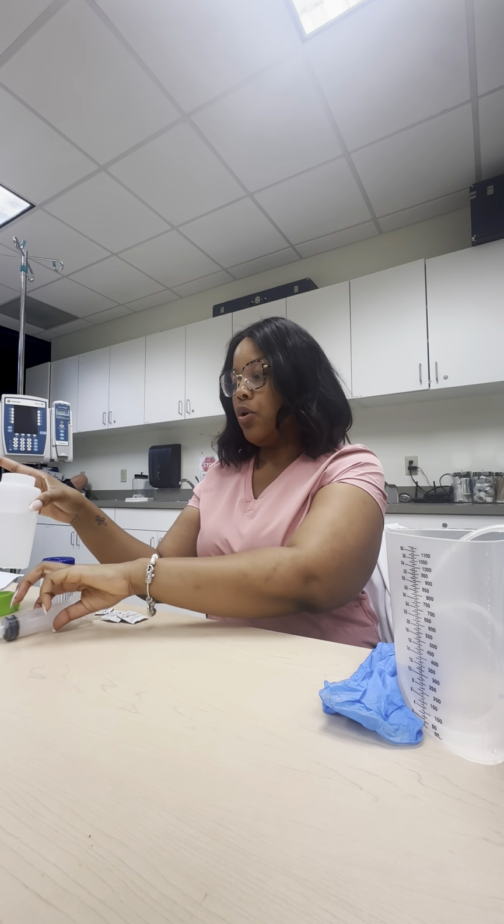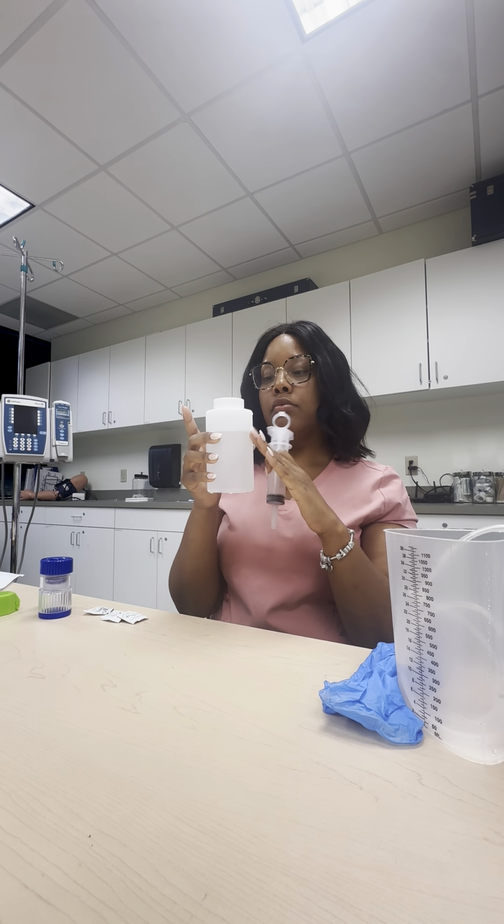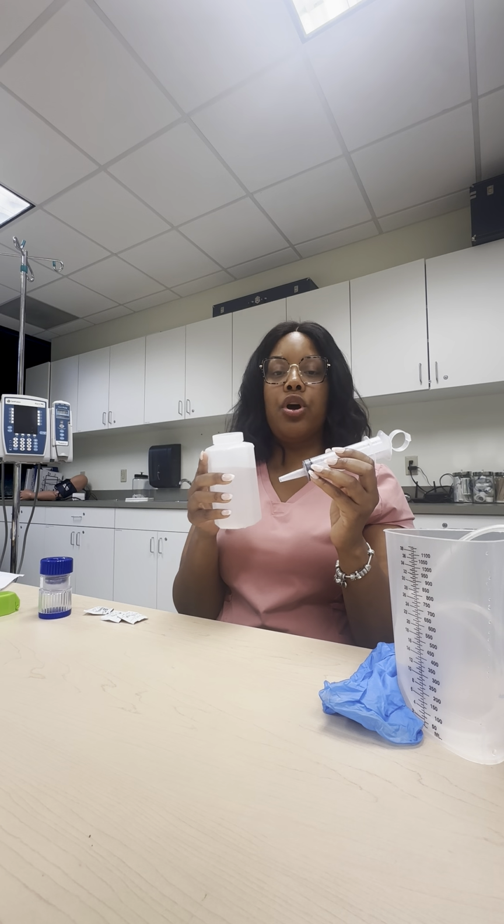So what do you need? So you need your irrigation set, which will be your actual syringe, and it will be your little container right here to put your water in. So you want to go ahead and put some water in it, okay?